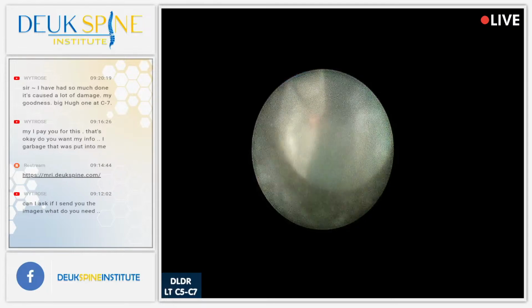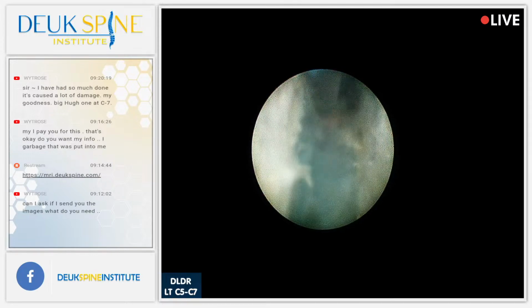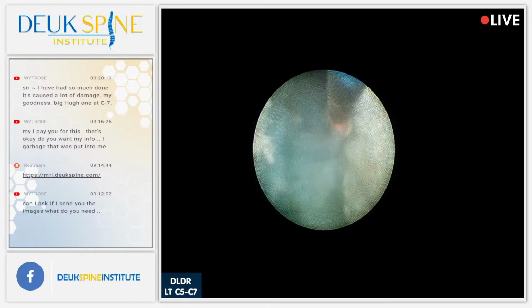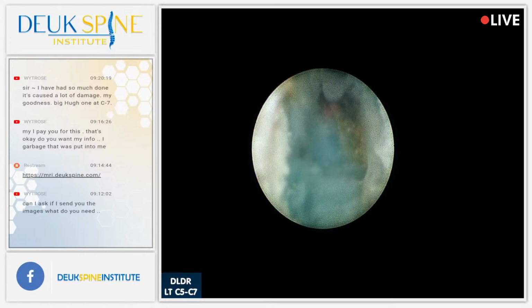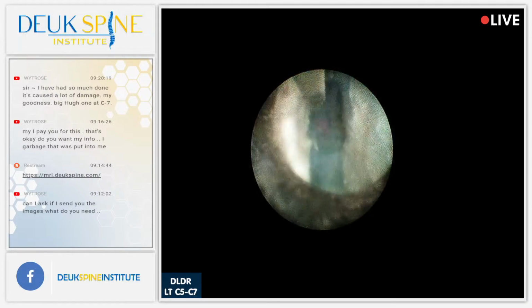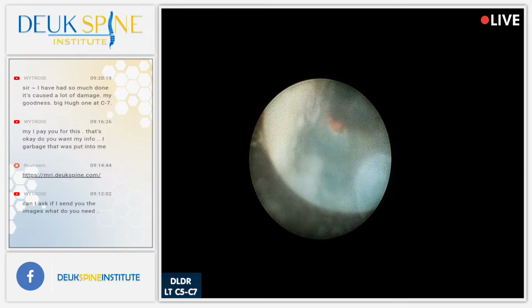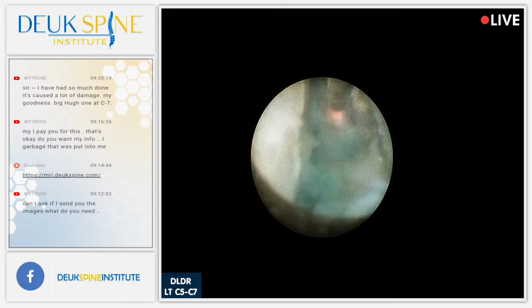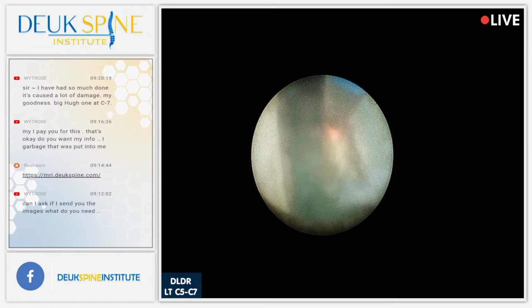I apologize, they just responded back. They said, "Sir, I have so much done. It's caused a lot of damage. My goodness, it's a big, huge herniation, I believe at C7." Yeah, no problem. There's no herniation we can't fix unless you have a very short, fat neck, which we'll figure out. That's the only time we have trouble, when somebody has a short neck and a high collarbone. But any surgeon's going to have trouble, even with anterior cervical decompression and fusion.